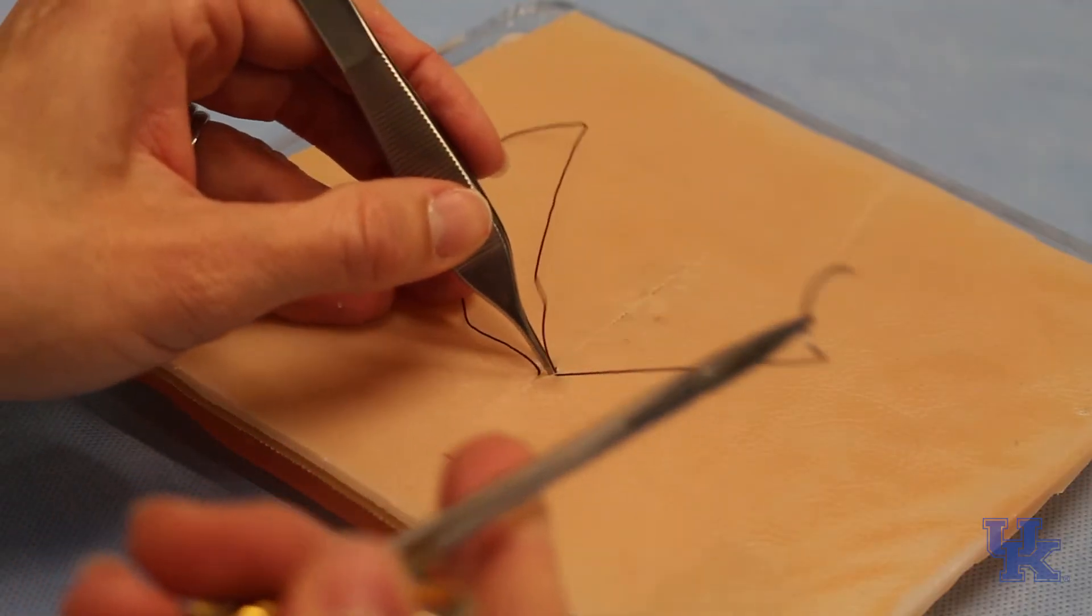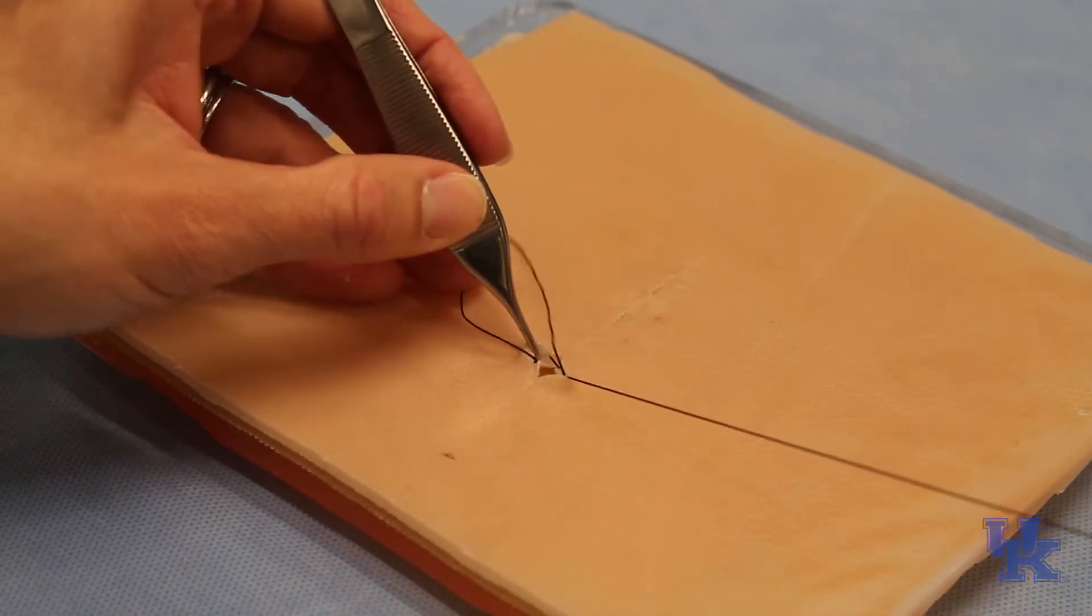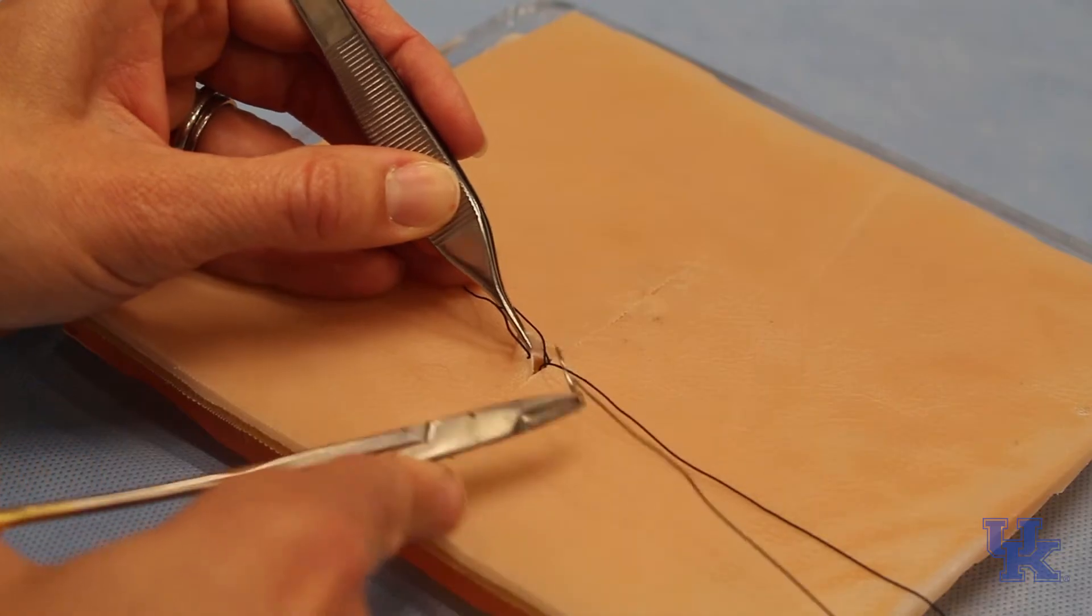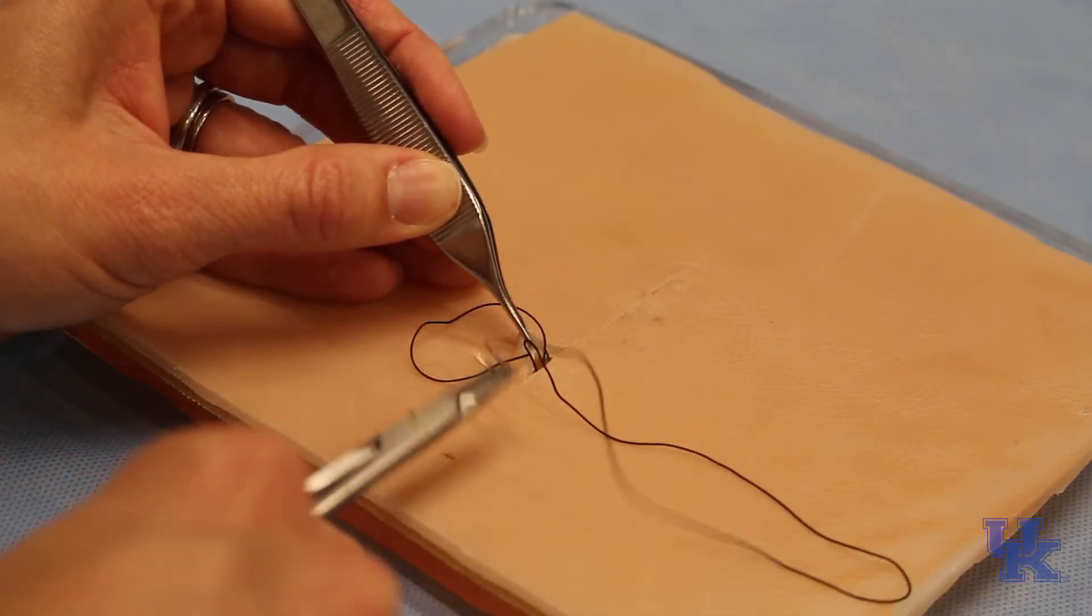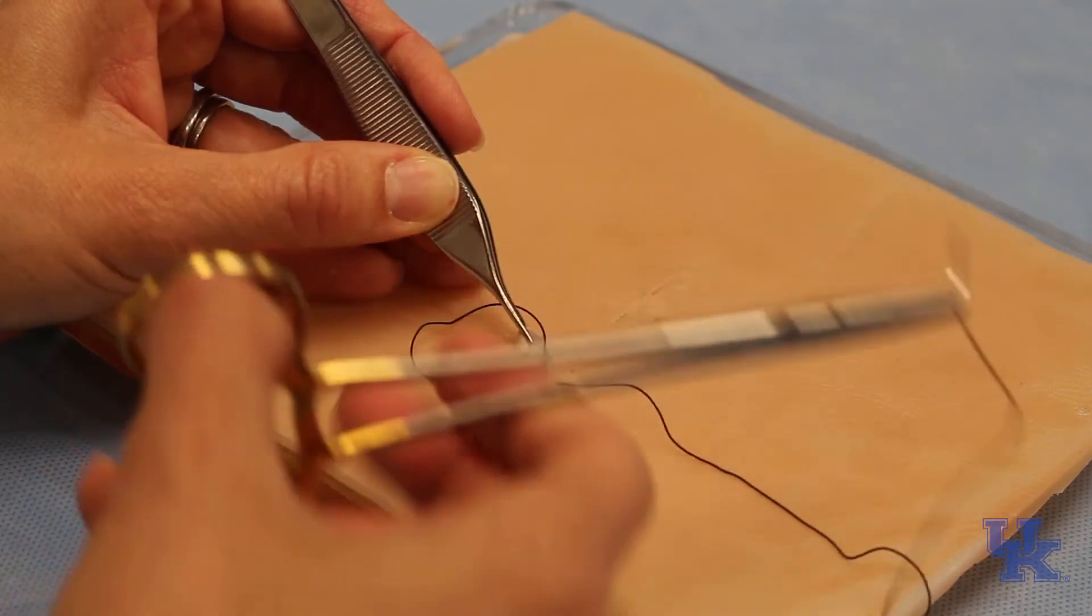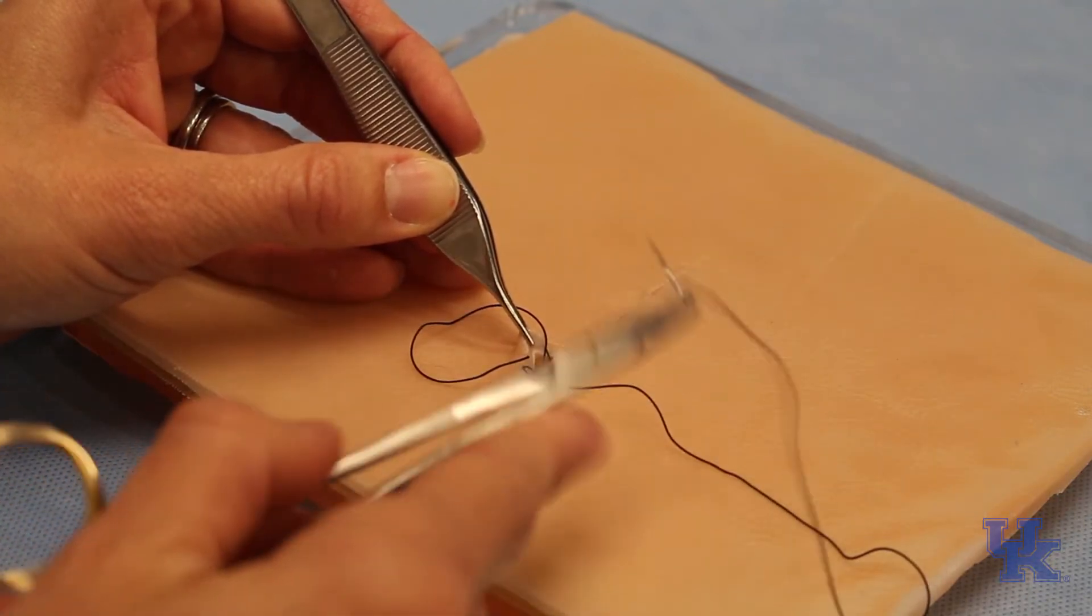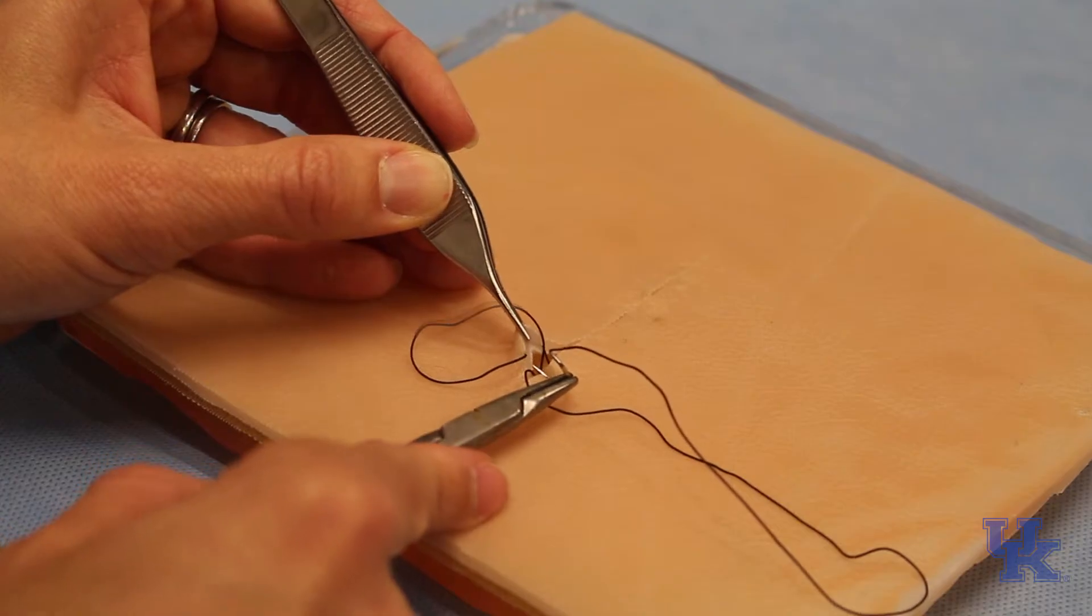Now what I like to do here, and this may be a little different, but I'm going to show you the way I do it. There's a lot of ways to skin the cat. This stitch is coming from deep. These two are coming from superficial. So if I tied this together right now, which I could, and a lot of people do, but my knot would have two anchors in superficial and one in deep.